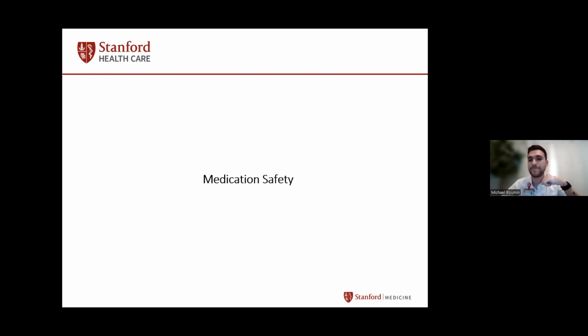Thank you. And the last question for this section is, are the continuous glucose monitors and sensors okay for everyone to use? And then let's say someone was diagnosed with type 2 diabetes, do they need to start checking their blood sugar, just make diet changes, or both? Yeah, good question. In terms of CGM, I can't really think of somebody it would not be appropriate for. I think if you're willing to use it, able to use the technology and able to get it covered or some way get it affordably, I would give it a try because, for all the reasons we had stated.